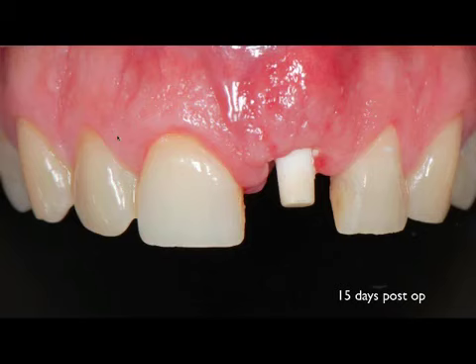Our protocol is to place the implant ideally, try to avoid preparation. If we can keep most of the bulk of that abutment there, that's our preferred way. We don't want to, because of an inadequately planned surgery, hack away half of that abutment. We need it for retention. It's much like a tooth. If you had a tooth there, you would want to minimize your preparation of that tooth because you don't want to get too close to the nerve, and you don't want to sacrifice tooth structure. The same philosophy, the same thinking is with the zirconia.